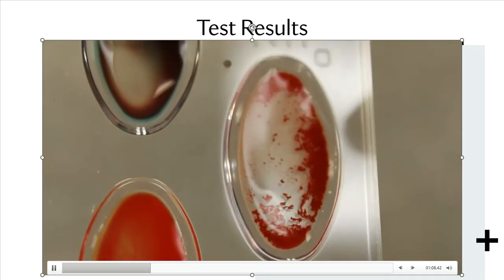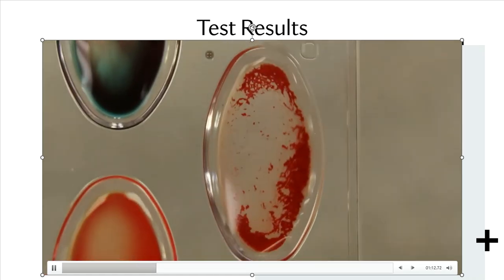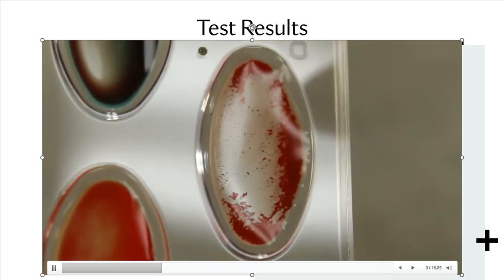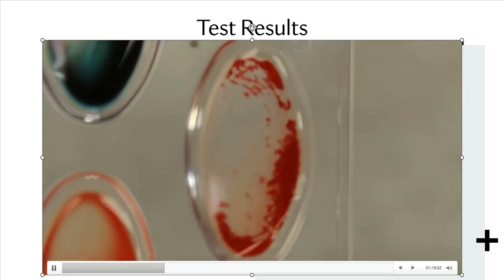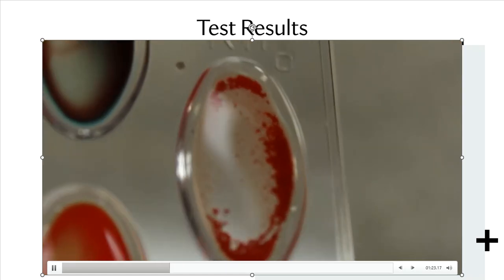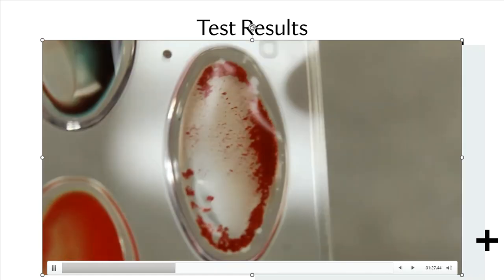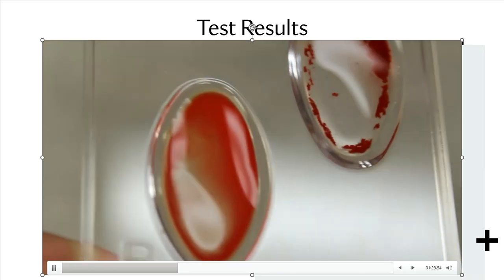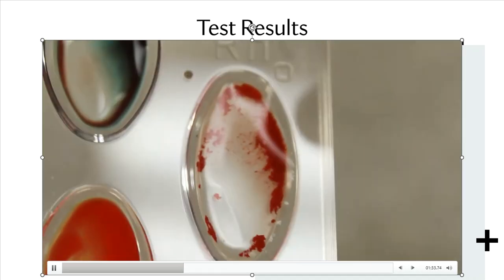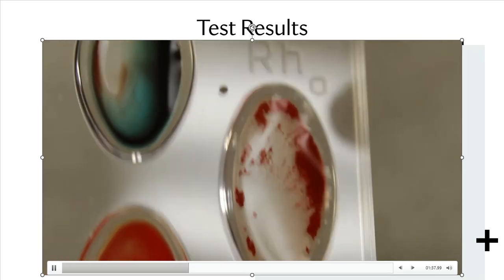As you can see, the blood is not uniform throughout the entire well. I really do have clumps that are beginning to form. I like to call it a lava lamp effect. A lot of these are staying together in smaller clumps or bigger clumps, and it doesn't look anything like the other wells. So that means that I have agglutinated in the RH well. I'm starting to see clumps of my blood.